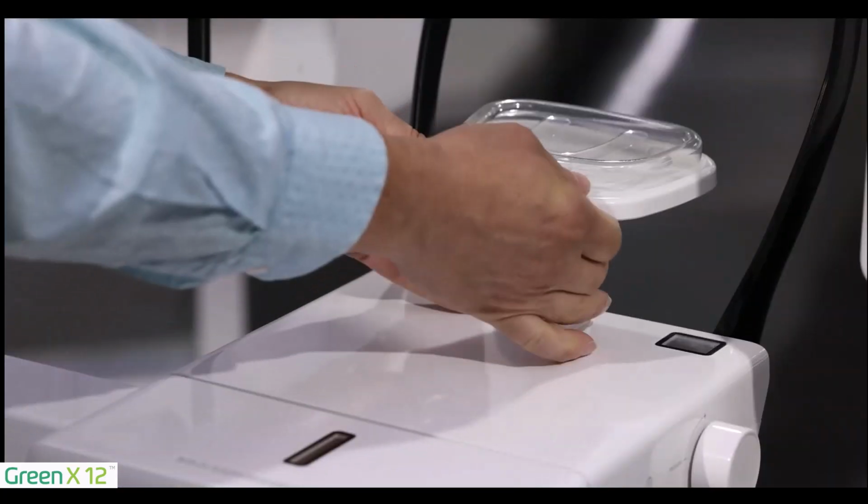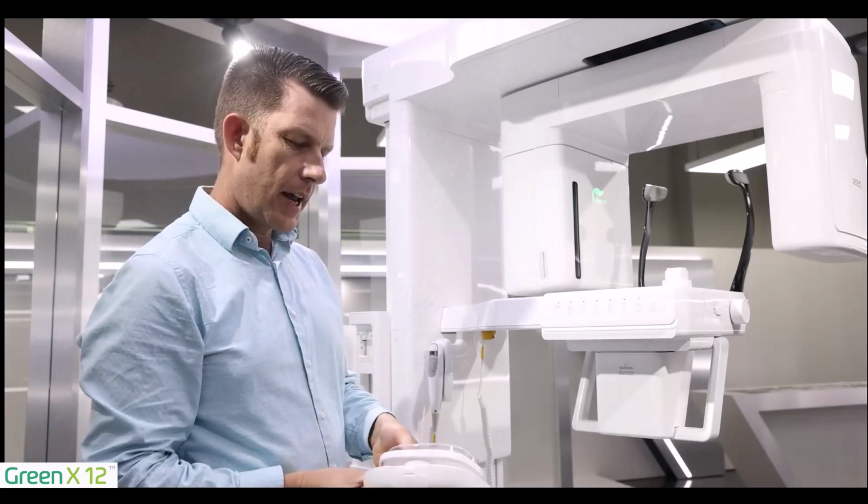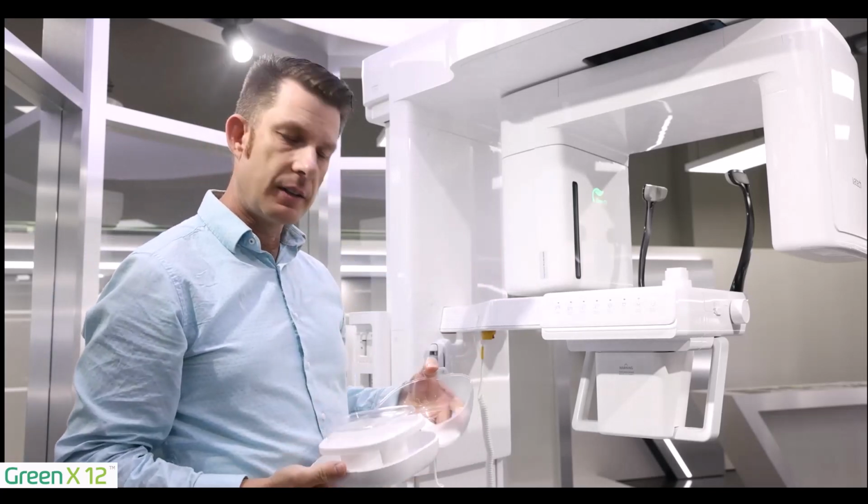So I'm going to go ahead and remove that. We'll put it back in its case here, and we're going to go ahead and place the chin rest back into the device.